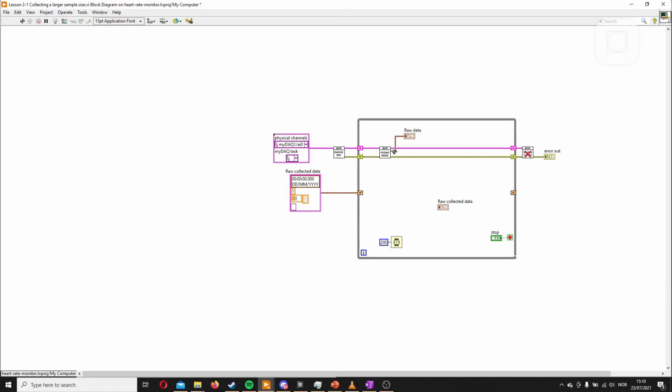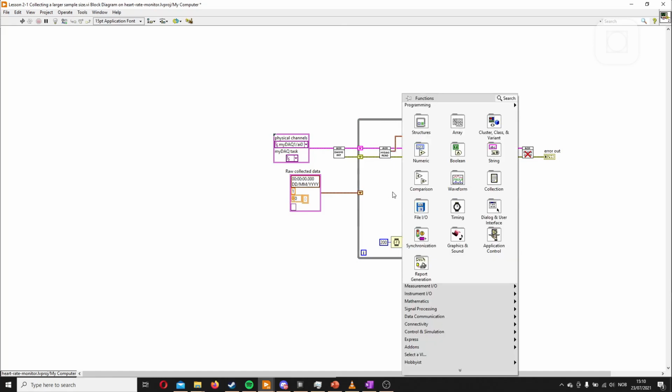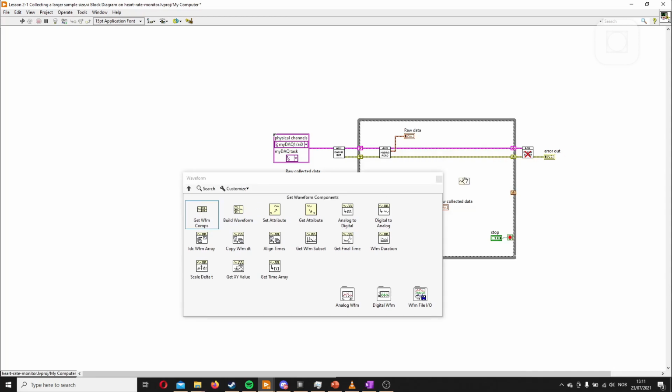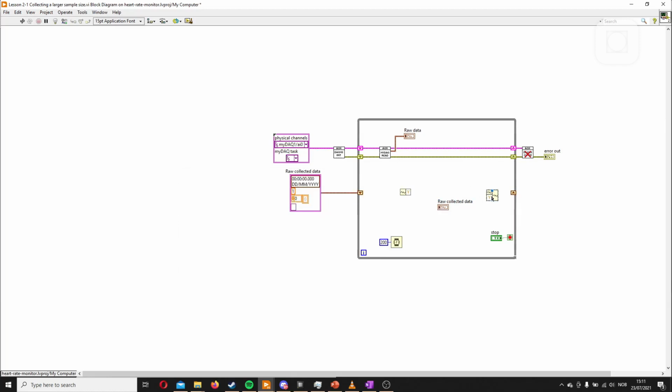So we need a way for this one to gather and be placed with this one. There's a couple of ways we can do this, and the easiest way is just to unbundle this one. But since it's a waveform rather than a cluster, we need to use the special ones here. So we'll just pin this one and then drag this one out. This is basically the unbundle, and this is the bundle. They're not clusters, but waveforms because they were made for LabVIEW before clusters existed. Some people at LabVIEW said that they would probably be clusters if they were invented now.